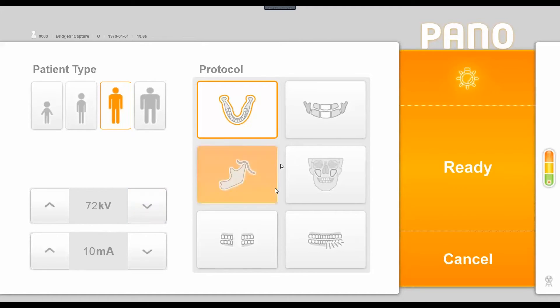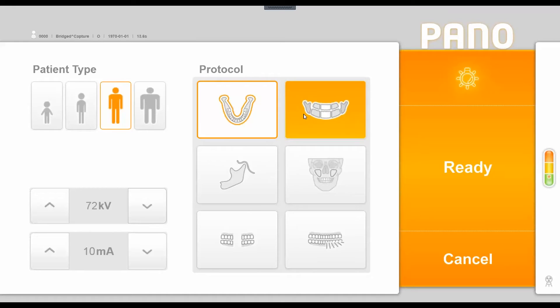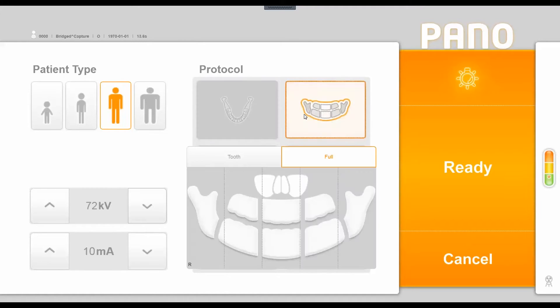The middle section of this window shows our protocol options, defaulting to the standard panoramic image. The option to the right lets you do segmented panoramics — you can select or deselect areas to be imaged. For example, you can gray out the TMJ so the machine still does the full rotation but only radiates the white areas, reducing unnecessary exposure.